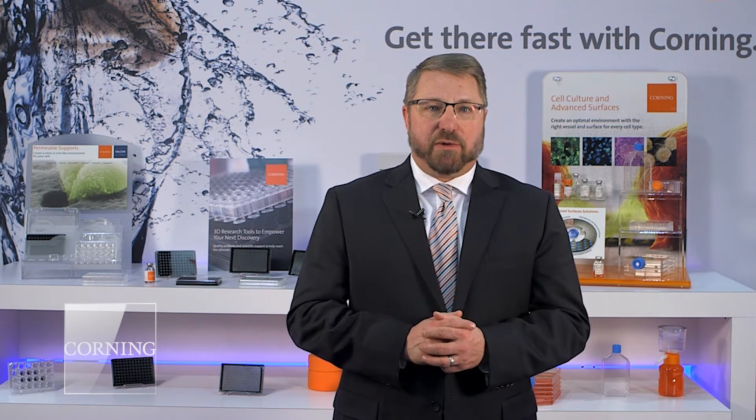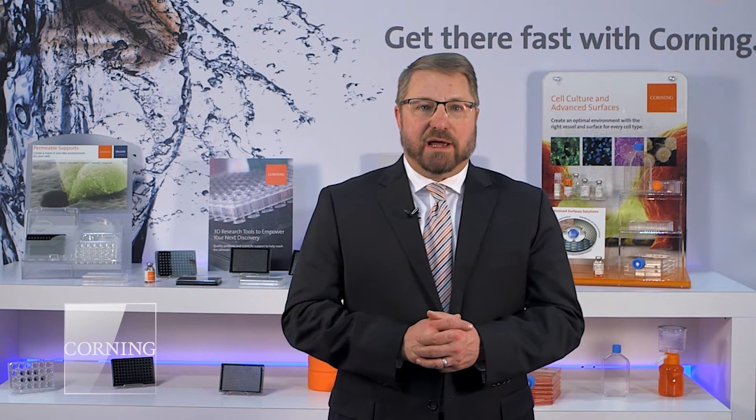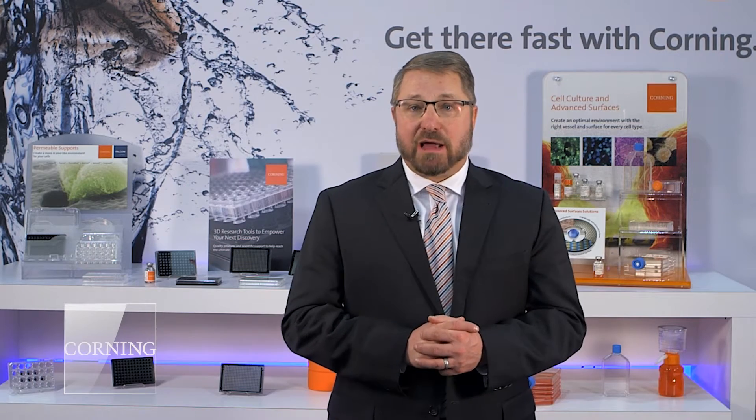I'm going to take you through what our workflow is, some of the new products that we have, and end with some of the things that we're highlighting at the show this year.